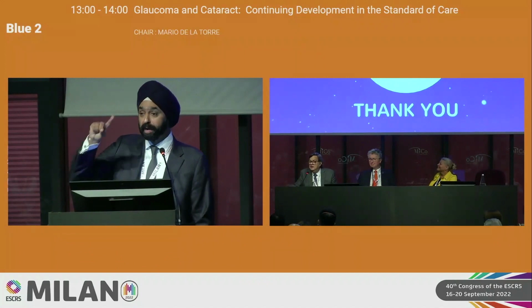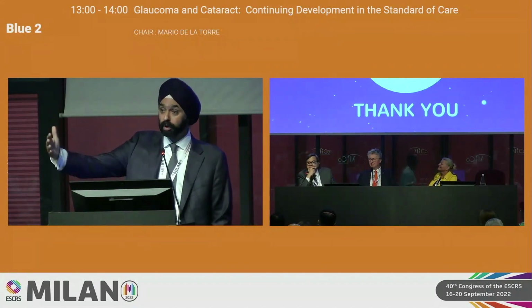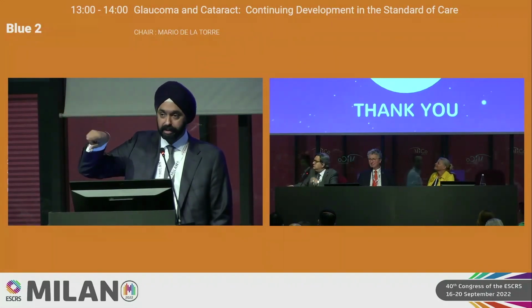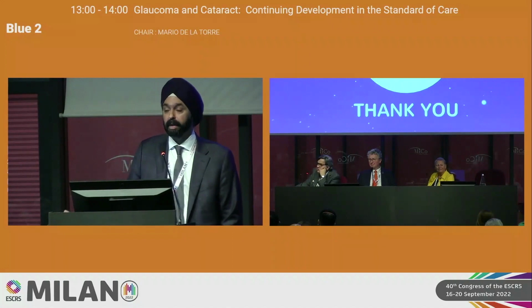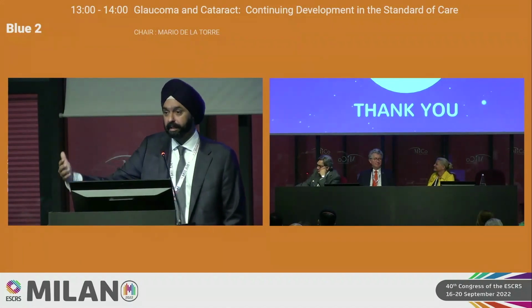So I do one 360-degree session, and that is my litmus test. If it does work well, and let's say it starts to climb up even at 3 or 4 months, or 6 months, I will repeat it. If after one session of 360 it did not do much, I don't repeat it again. That's probably a patient who has resistance beyond the TM. But I'll do a second or third session over time if it did have an effect initially.